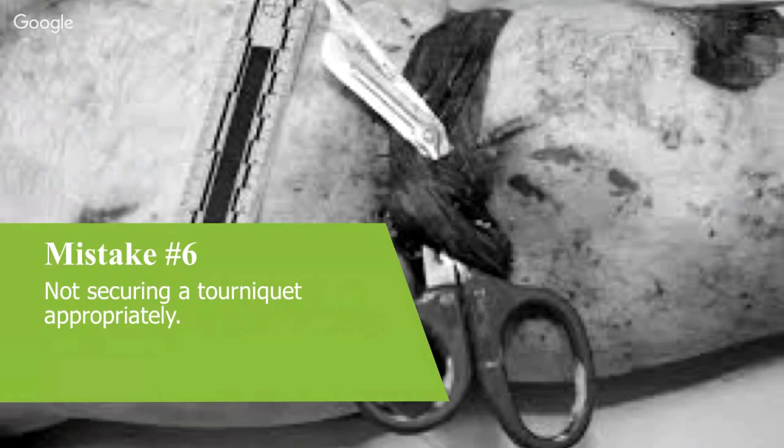Now, I've got two views on this. One, obviously, that'll prevent it from unwrapping. But if you then need to retighten that tourniquet after a move, say it becomes ineffective and you start to have rebleeding of the wound, and you've got a bunch of duct tape wrapped around the CAT tourniquet, you then need to try and undo that sticky tape, probably with gloves or blood on your hands, and then undo that tape to retighten.